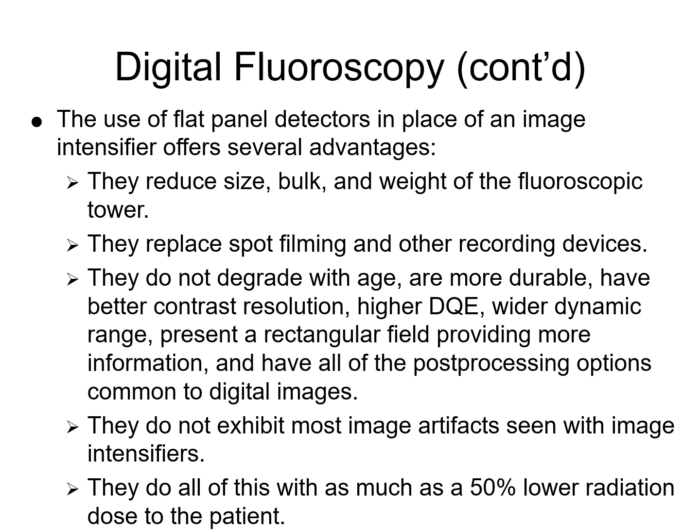Okay, so you can do the flat panel detector, and the coupled software replaces all of those things that were necessary coupled to the regular television video camera. So the spot film imager was coupled. We don't need a separate spot film imager anymore. The flat panel detector can take a conventional X-ray just as well as a motion picture X-ray, and so it can swap to a still image processing software rather than motion picture processing software.